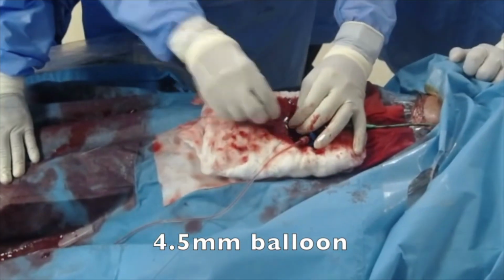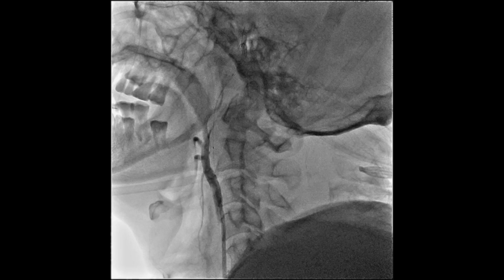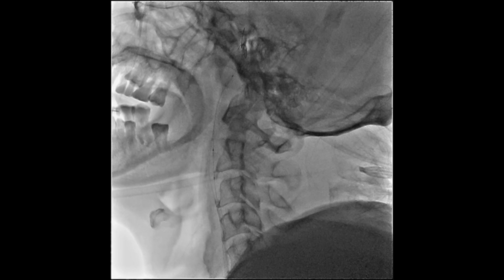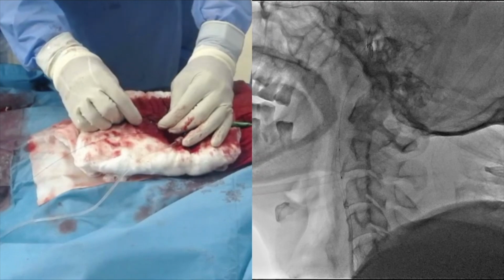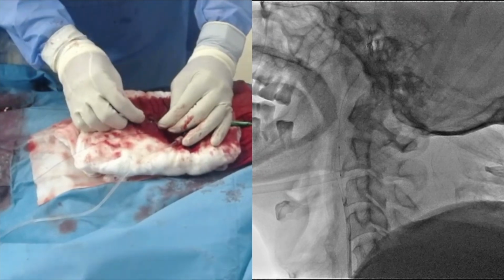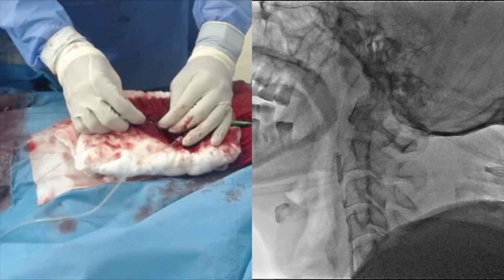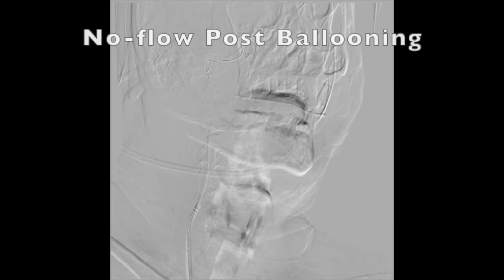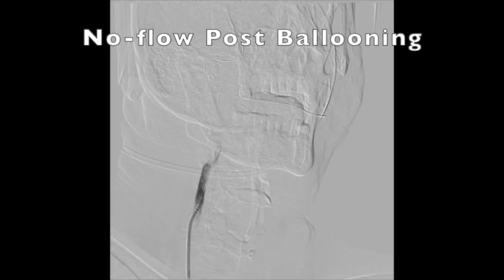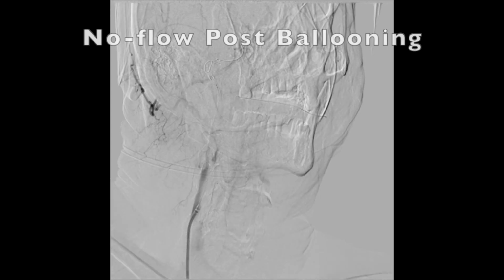I used a 4.5 millimeter balloon for pre-dilatation, and after pre-dilatation you can see that I had a no reflow. So why did I get a no reflow? What's the reason for that? Is it distal embolization that's taken place? Is the filter full of clots, or have I deployed the filter in a false lumen and all pre-dilatation has been done in false lumen? So what should I do next?